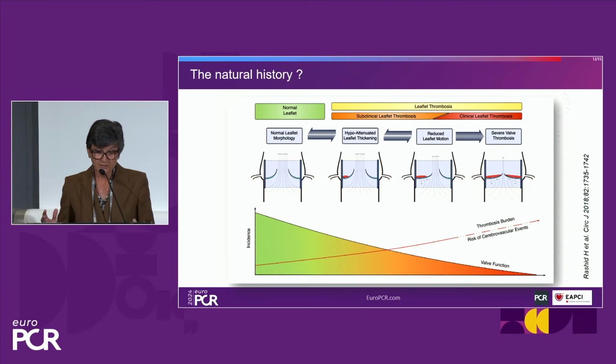So what is the possible natural history of HALT? Nobody knows today, but this natural history graph was suggested by the team of Rashid et al. from Australia.